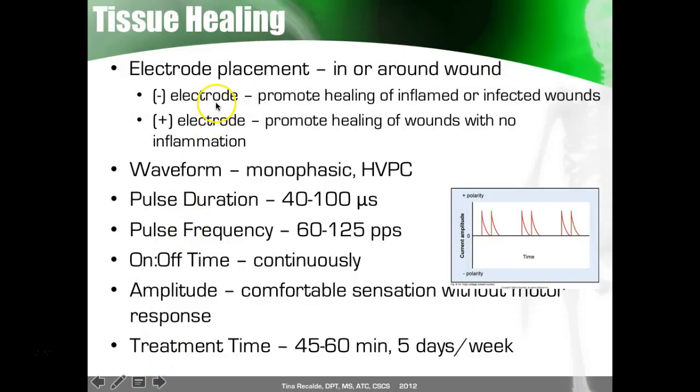We can also use electrical stim for tissue healing. This is where we're going to tend to use more of a high volt pulse current. So I'm going to stop right there.